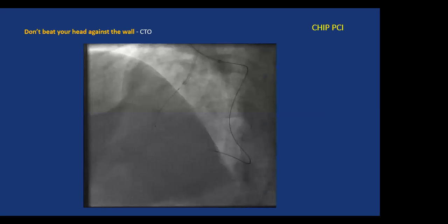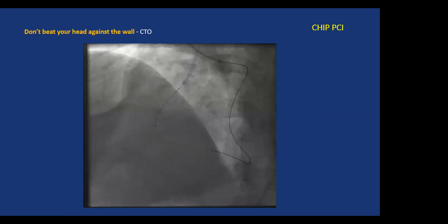This is how a CTO procedure looks — just before stent deployment, we're using two catheters. We have a wire that went through the left system, through the septal, retrograde into the RCA, back to the RCA antegrade guide, and out. So this particular wire goes from the right radial all the way through the heart, through the septum, and back out through the right groin. Then we can use it as a rail, with the microcatheter and the stent to be deployed.